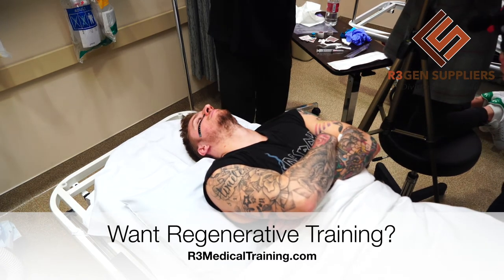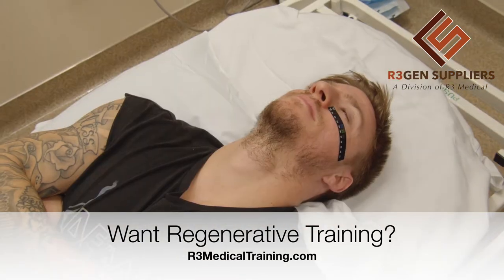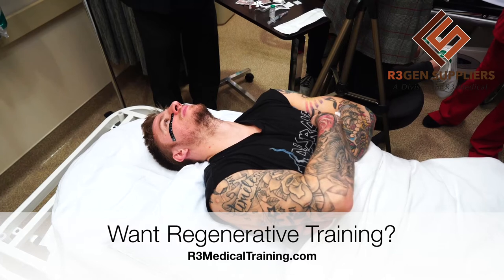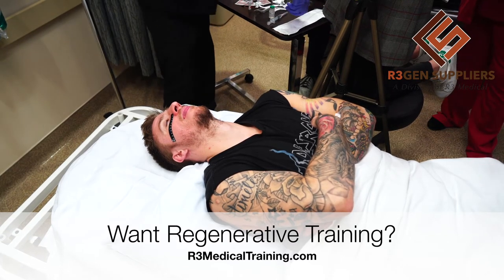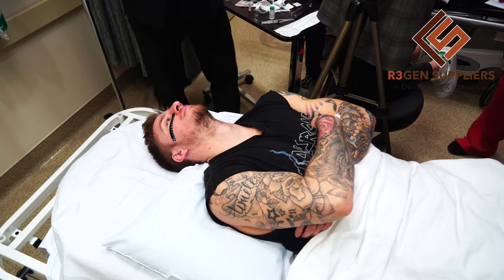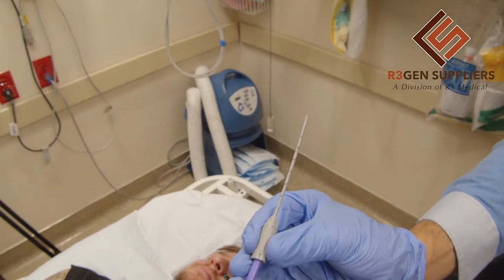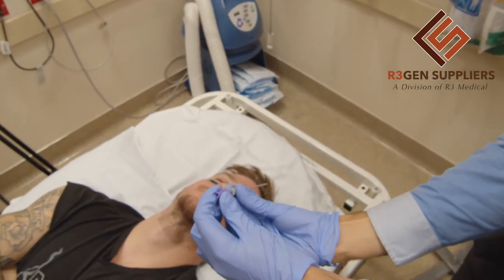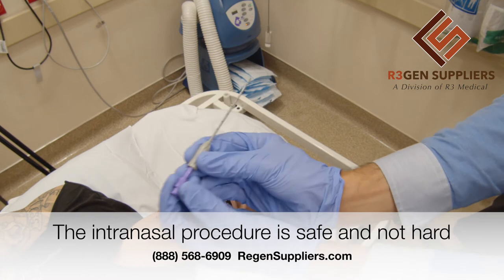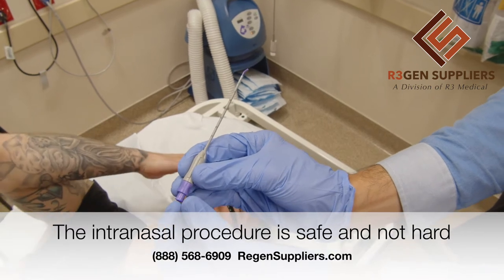That looks like it's ready. It can be anywhere between half to two. We want to make sure he keeps his head tilted back and extended to get as much of that medication as possible. So this is how it looks when we pull it out — it has this retractable probe. The way we insert it is following the cavity of the nose, and once we're in the right spot, we open up and deploy the probe, which is where we inject the medication.